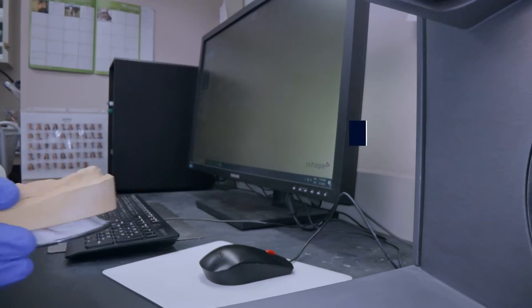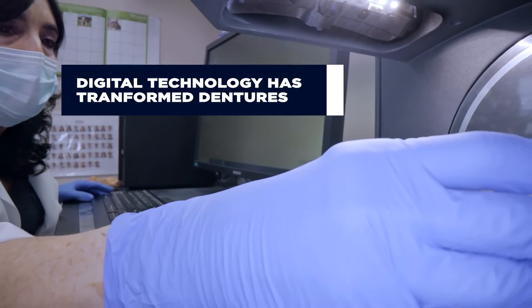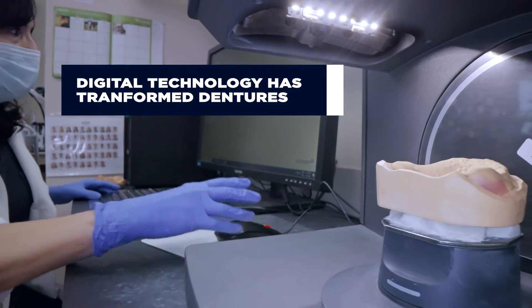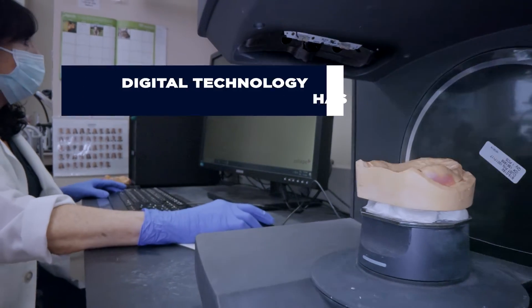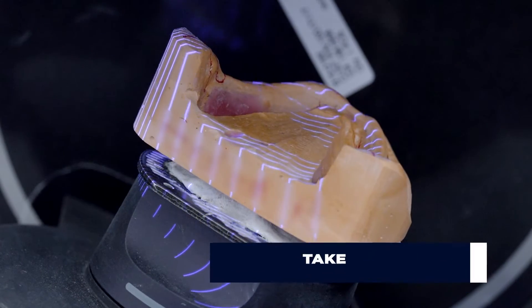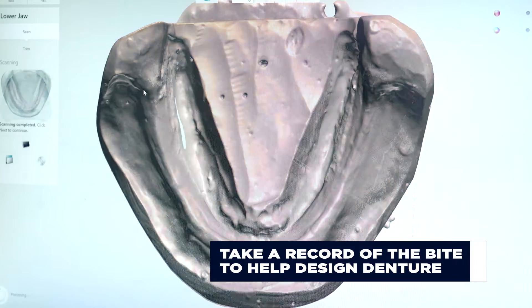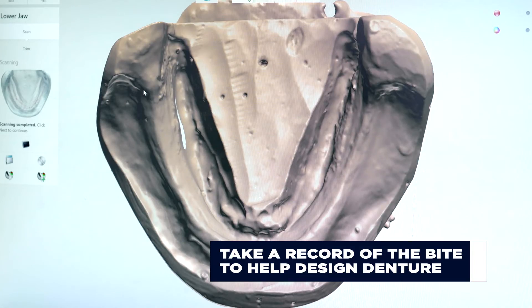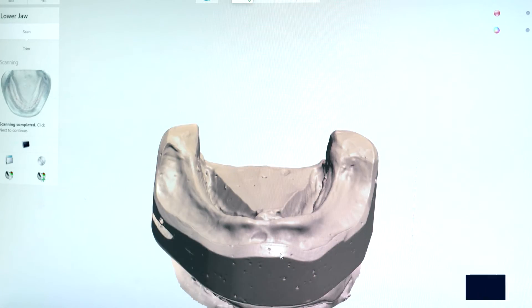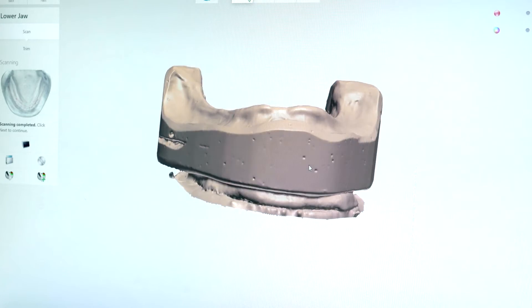Digital technology has completely transformed the way we practice dentistry. We make an impression and we take a record of the bite. The lab technician can then utilize this information in the computer-aided design software.